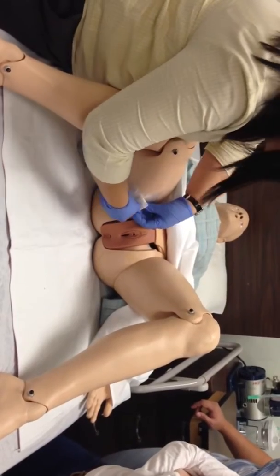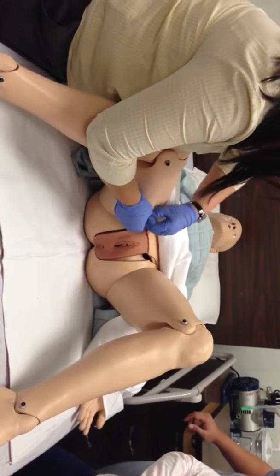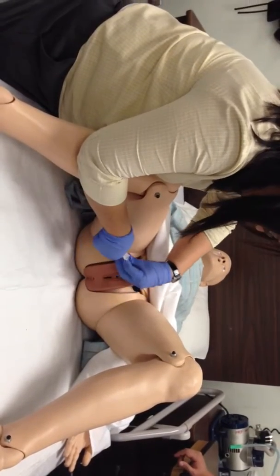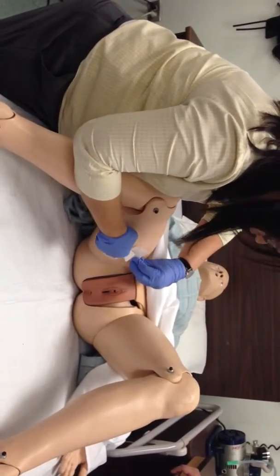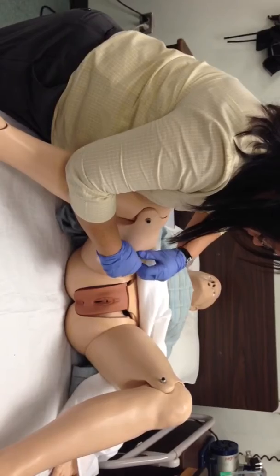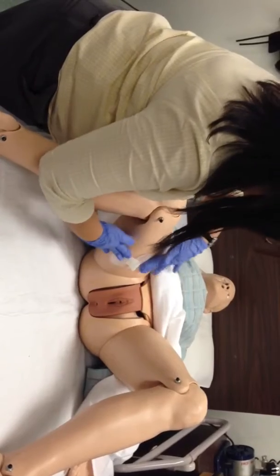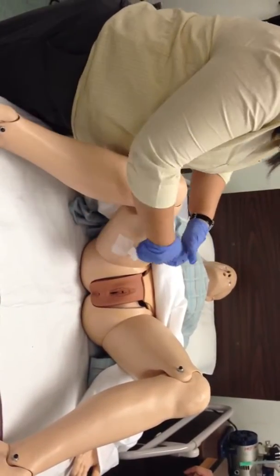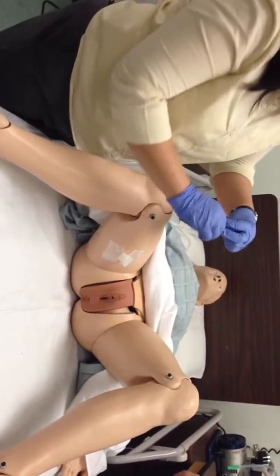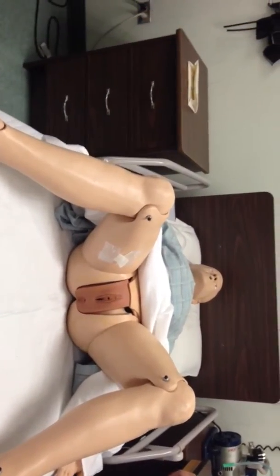I don't know who put this over here. Let me put this. It's getting stuck to your gloves. Yeah, this is too close. Actually, it's gonna be too inconvenient and also very uncomfortable for the patient. Again, it has to be in the right place. Don't put it over here. Anyway, you put it over here. All right. Very easy to peel. Very easy to put. Okay, so this is how it looks like.